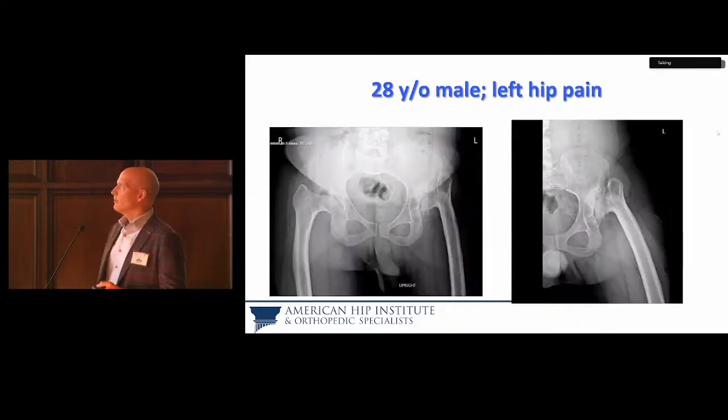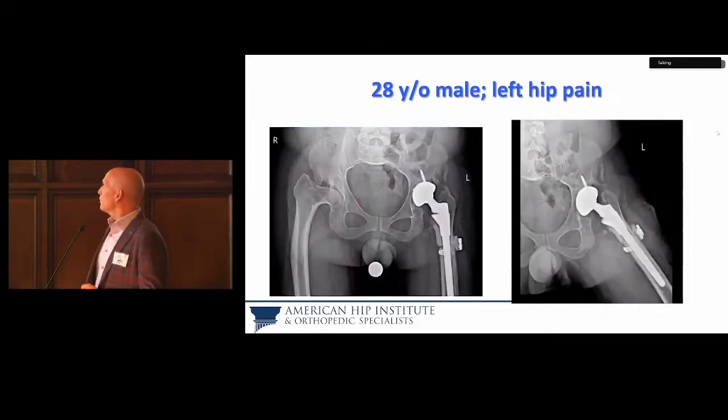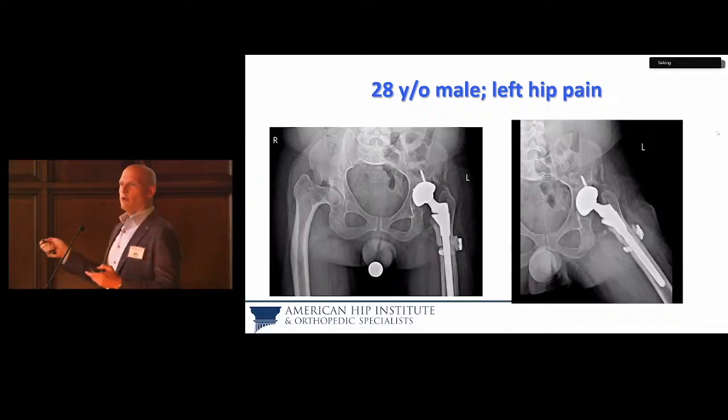And then just one final case. This gentleman here, 28-year-old male. Again, he has quite a shortening, greater trochanter almost up to the iliac crest. So on this one, yeah, I went ahead and did the femoral shortening osteotomy. Again, used the SROM.